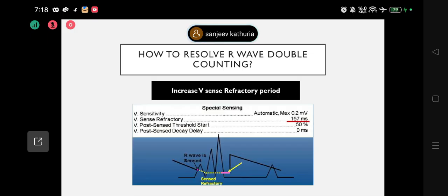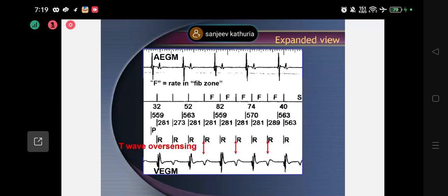So that is why now all ICDs in the world have auto sensitivity testing. They keep testing it after every 380 beats, 400 beats, it rechecks. Is the sensitivity the same? It says no, the R wave has decreased, let's say after 2 years. Then it will increase its sensitivity on its own. That's known as the tracking principle of new VTs. So whatever I've taught you now, the machine does maximum on its own.